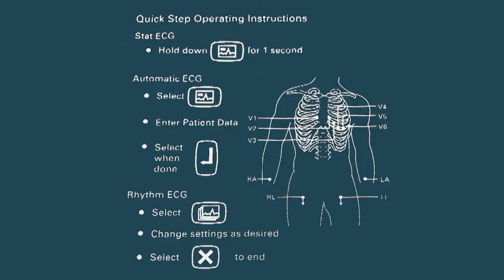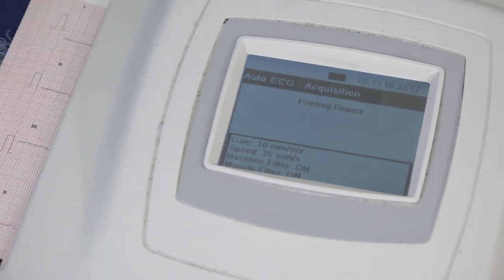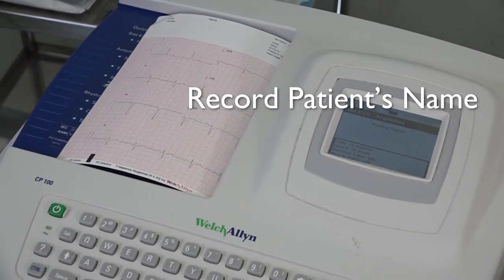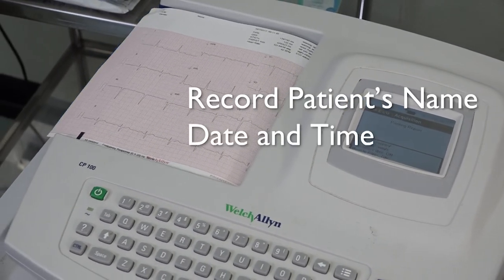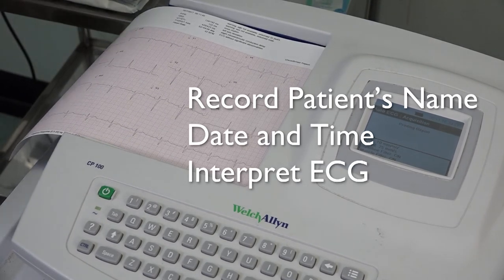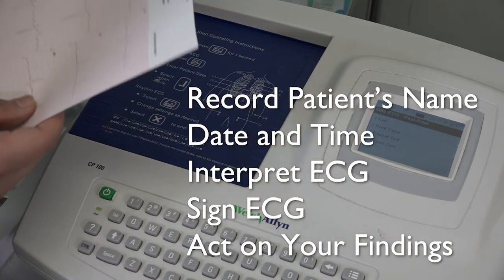Follow the machine's instructions to perform the 12-lead ECG. When you are happy with the trace, record the patient's name, the date and the time. Interpret the ECG, sign it, and act on your findings if necessary.